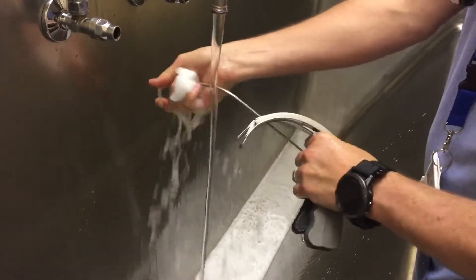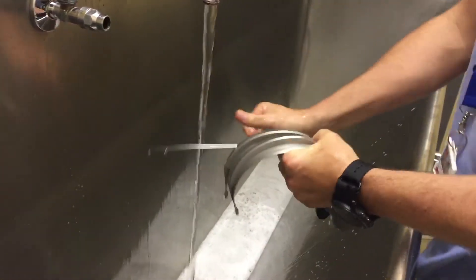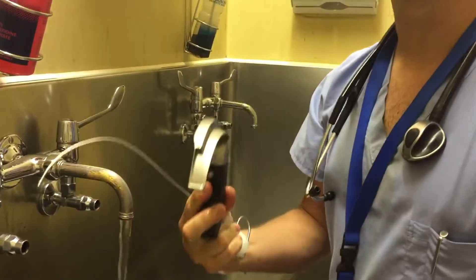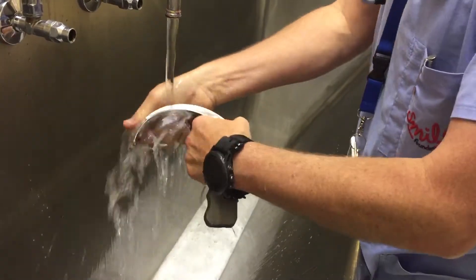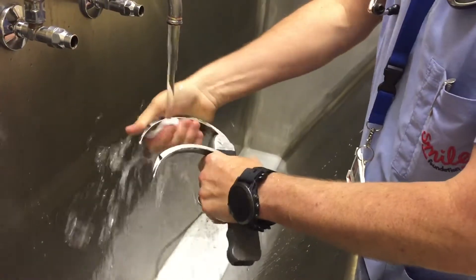How do you know that you've cleaned it enough? That you've washed it well enough? When you are prepared to lick the blade, then it is clean enough. If you're not prepared to lick the blade, the blade is not clean enough. Clean it some more.